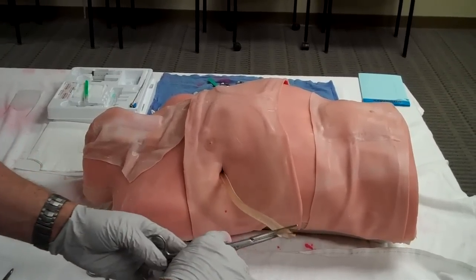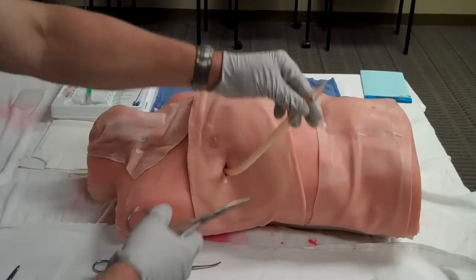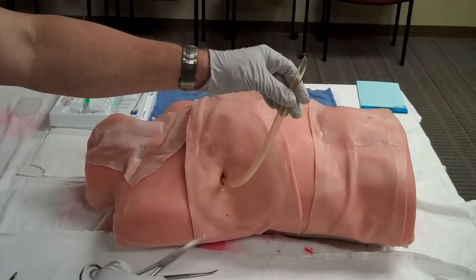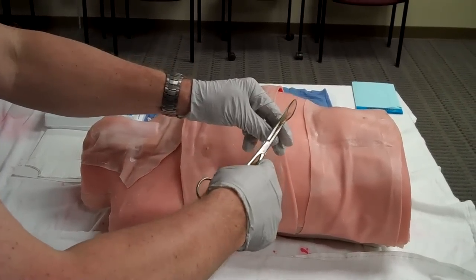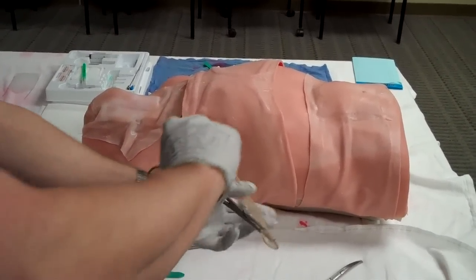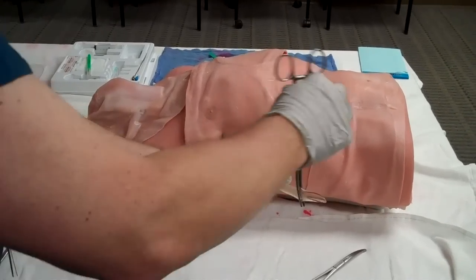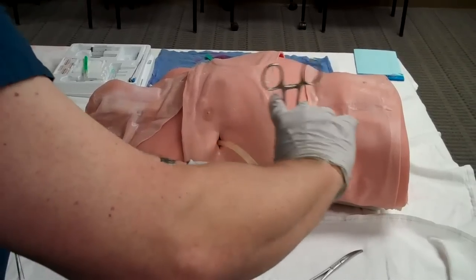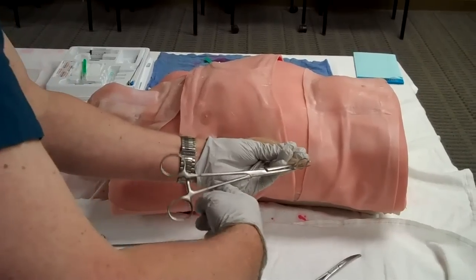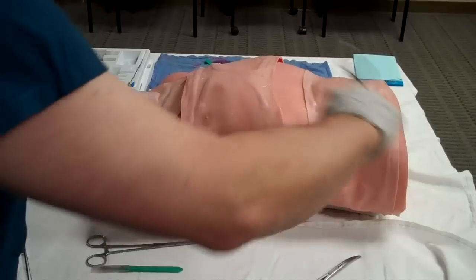Another way that you can check to make sure your tube is in good condition is, first, unclamp it and see if it fogs as the patient breathes. If you see fog in the tube, that means it's probably in the right place. And a way to make sure that it's not kinked is that you can put the clamp back on and then rotate it like this. If it rotates freely, then there is no kink in the tube. If there is a bend in the tube, what will happen is it will go freely, it'll get tight, and then it'll suddenly release, go forward, and then you'll just get these jerky sensations like that.